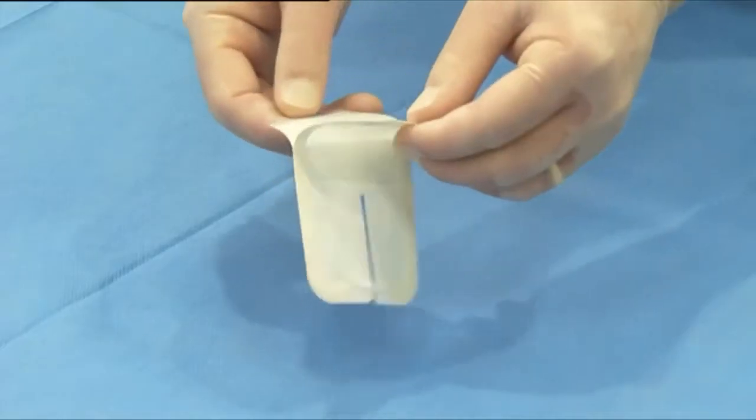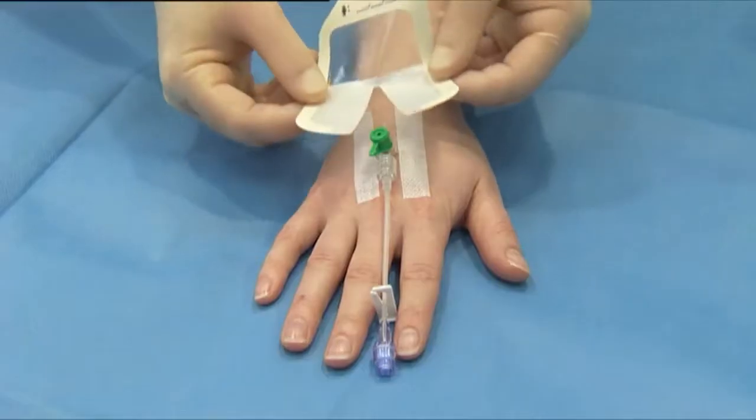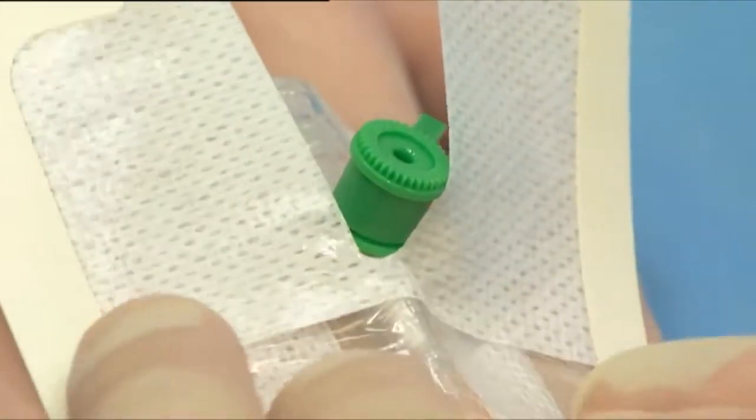Peel the paper liner from the paper frame dressing, exposing the adhesive surface. Place the dressing over the catheter so that the transparent film is over the insertion site.